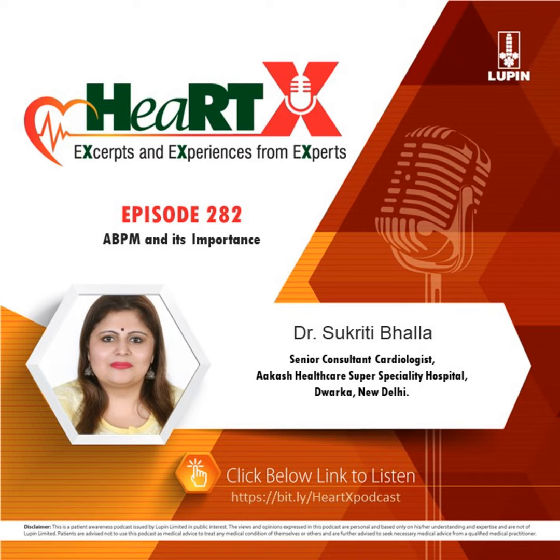So, what are the advantages? It is a better predictor of hypertension-mediated organ damage than office blood pressure. A 24-hour ambulatory BP mean has been consistently shown to have a closer relationship with morbid or fatal events, a more sensitive risk predictor than office blood pressure of cardiovascular outcomes such as coronary morbid or fatal events and stroke. It can identify white coat and masked hypertension, has stronger prognostic evidence, good nighttime readings can be taken, measurement in real life settings, additional prognostic blood pressure phenotypes, and abundant information from a single measurement session, including short term BP variability, can be noted.